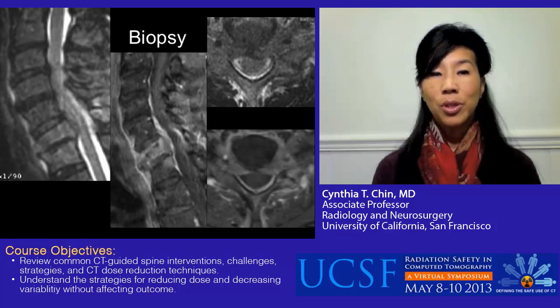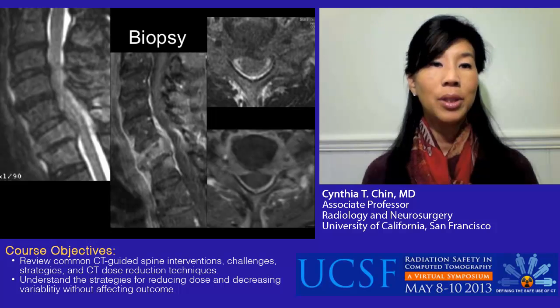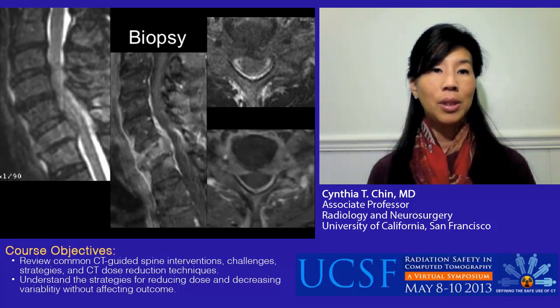These MR images in the sagittal and axial plane with and without gadolinium show that there is abnormal enhancement and abnormal extension into the epidural space at the level of the metastatic involvement, and that it involves not just the bony structure but also the soft tissue.